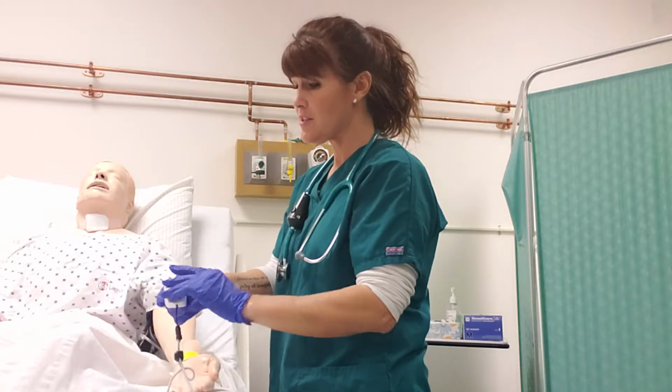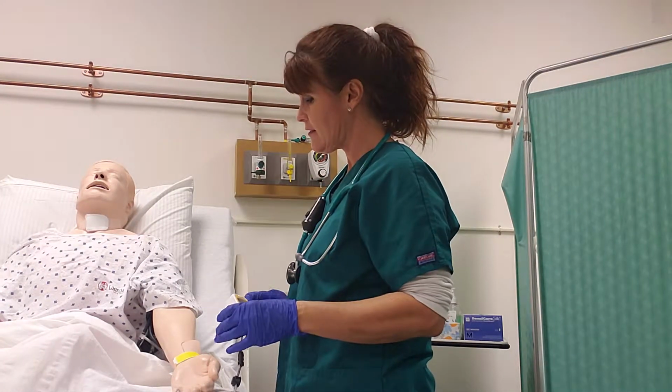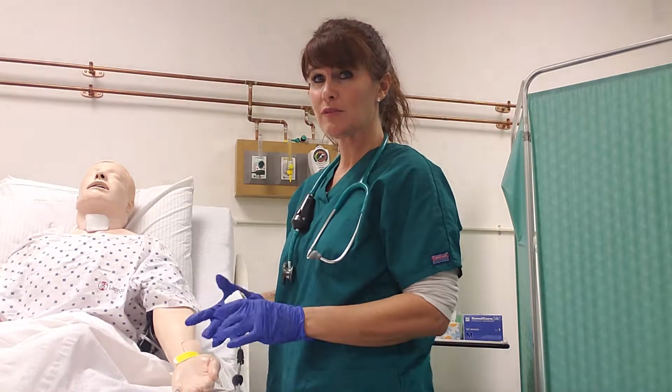So at this time, you want to check your patient's SpO2. You want to get their heart rate and their respiratory rate.